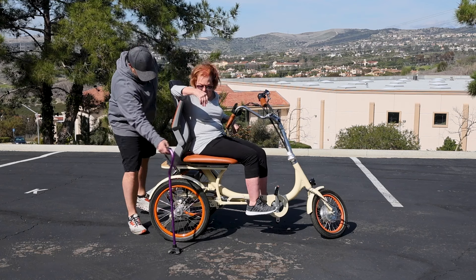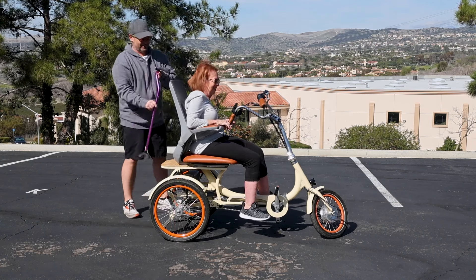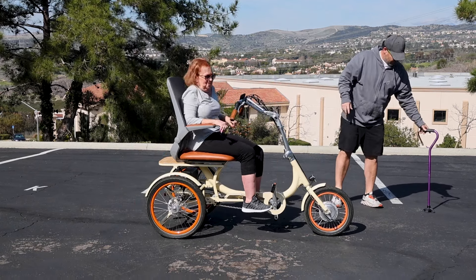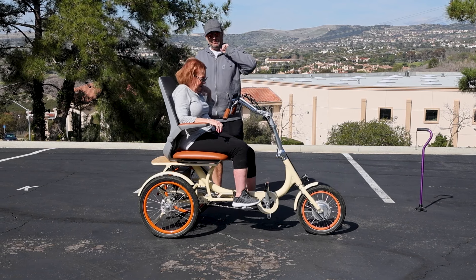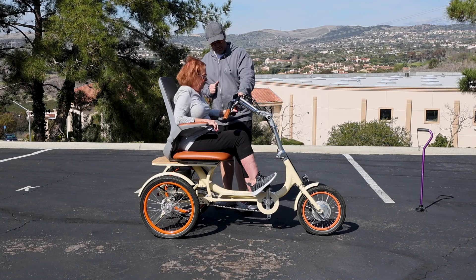For the cane, we could actually find a cane holder back here — we'll have to find a better spot for that. She has to sit a little bit forward to reach the pedals right now. We're going to fix that in production so you can slide forward, but she can get her feet on the pedals.